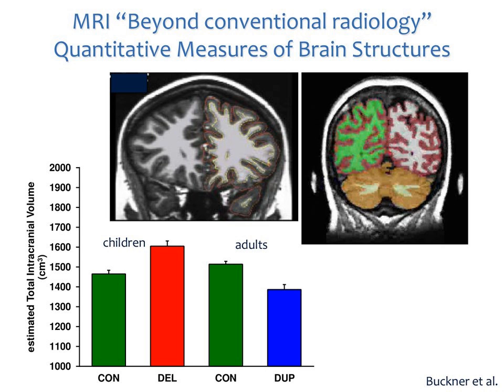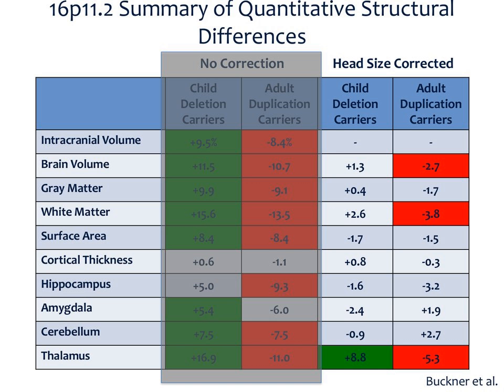So this is really just giving us some insight into the level of quantitative, not qualitative detail that can be obtained using three-dimensional MRI.